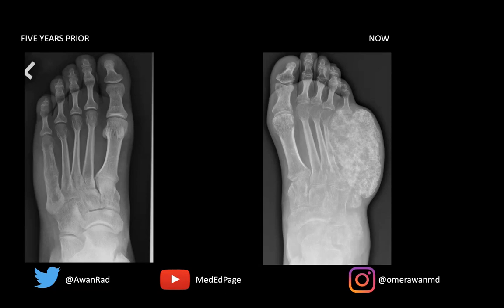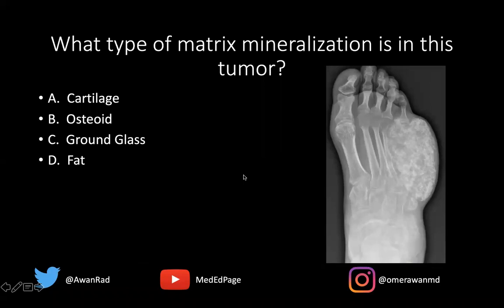Here we have a frontal radiograph of the left foot from five years ago and a frontal radiograph of the same patient's left foot now. The question I have for you is: what type of matrix mineralization is in this tumor? Is it cartilage, osteoid, ground glass, or fat?